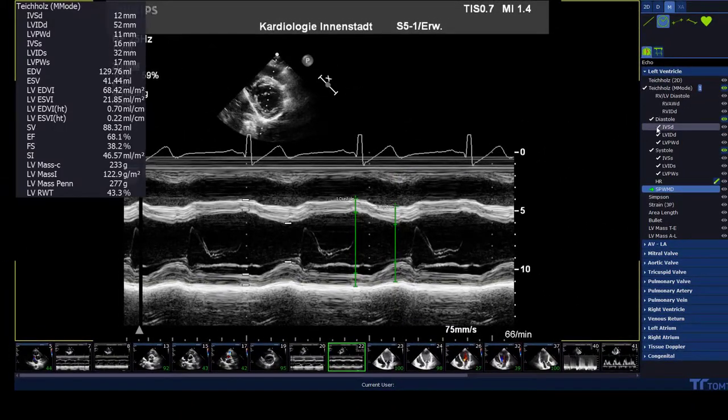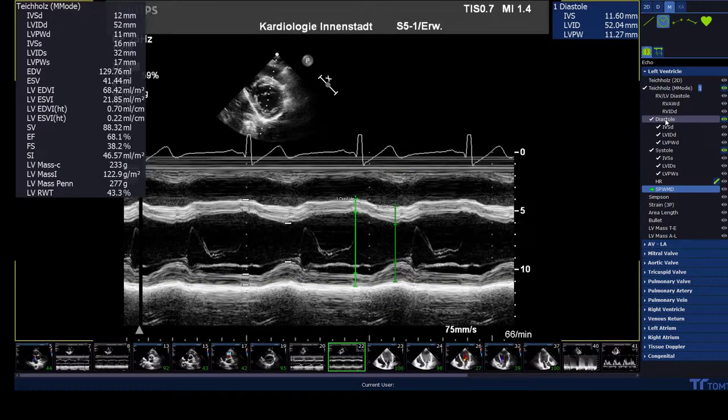In the end, the results can be reviewed on the left side by moving the mouse over the opened package in the measurement menu.